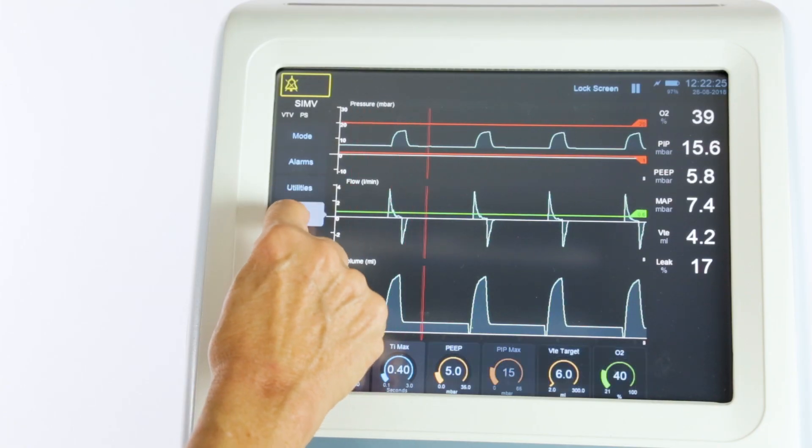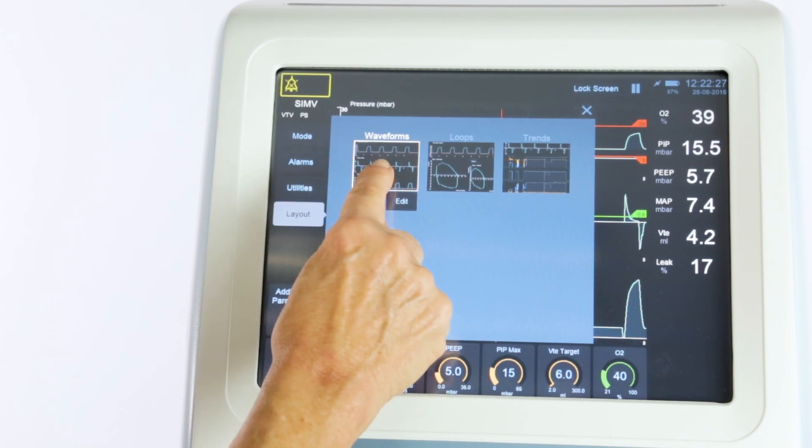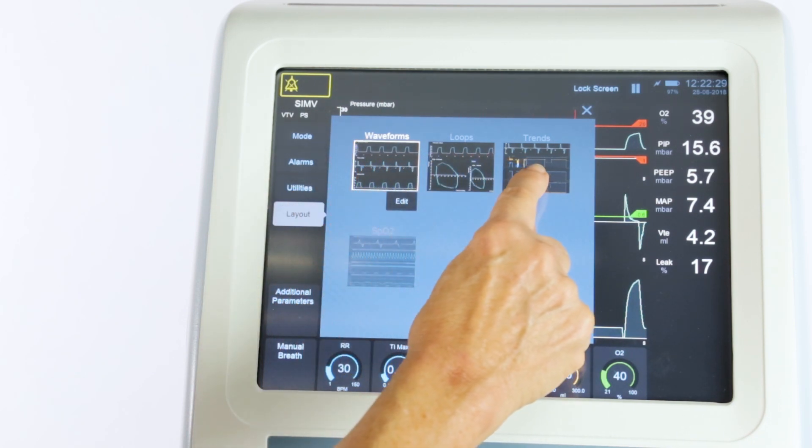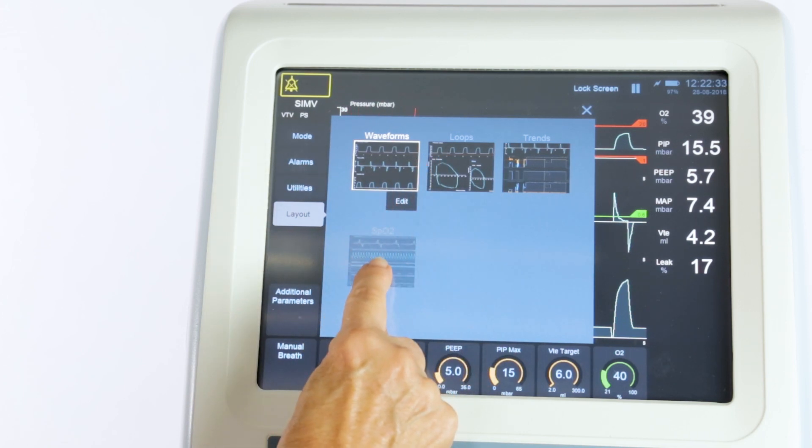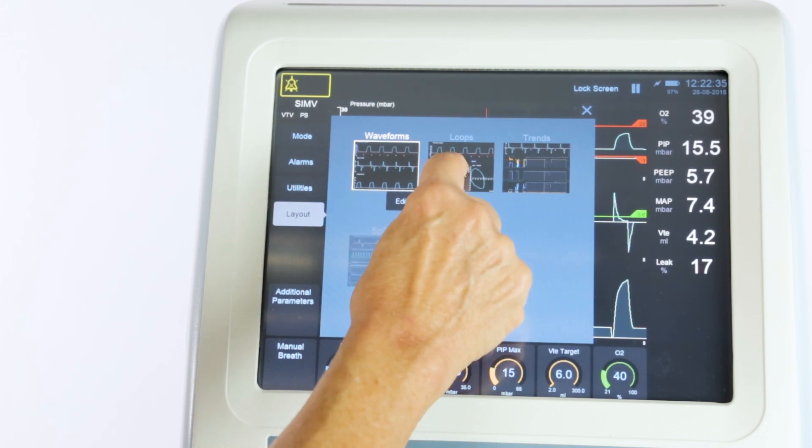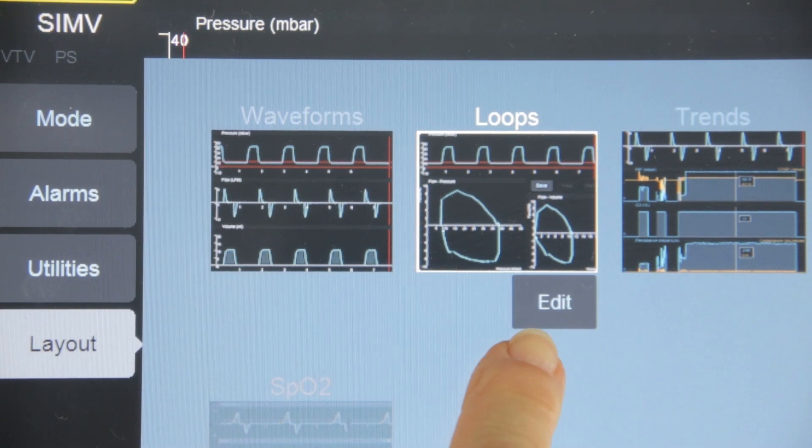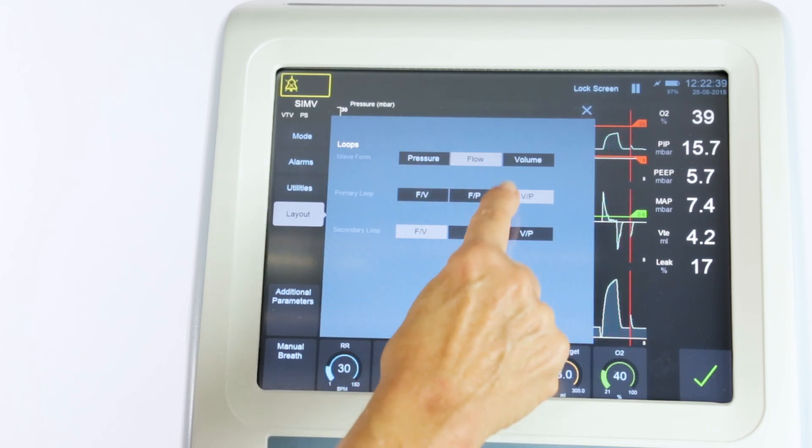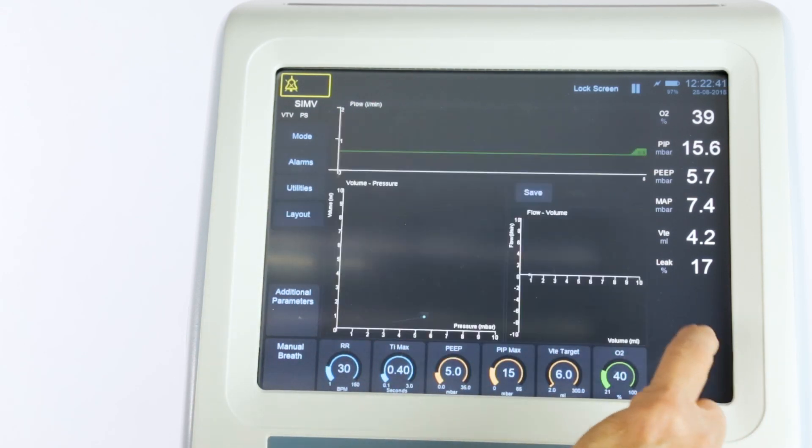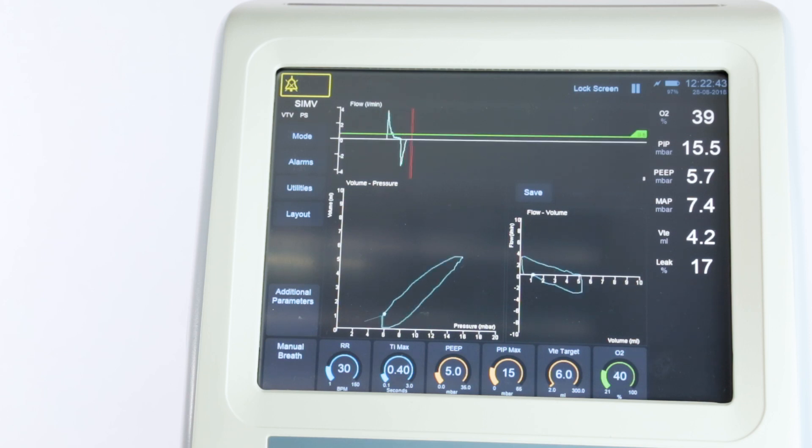The Layout button gives access to a page which allows you to switch between various screen layouts, including waveforms only, trends, loops and SPO2 if installed. When one of these buttons is selected, a small Edit button appears beneath it. Selecting this allows you to modify that particular screen before confirming it, and pressing the Tick button will cause the ventilator to show an alternative layout.